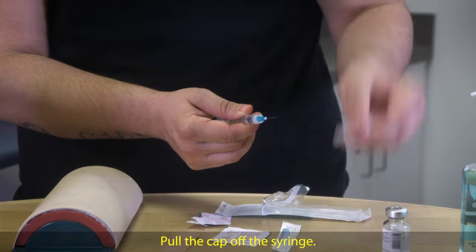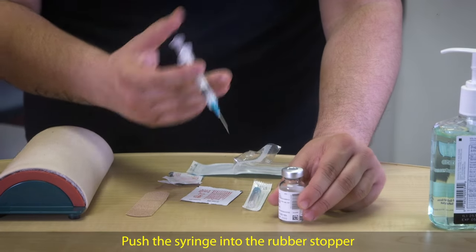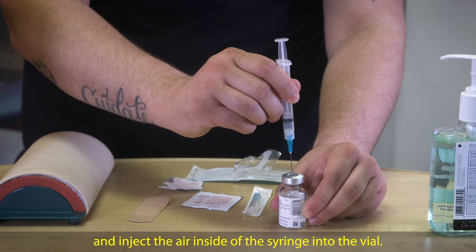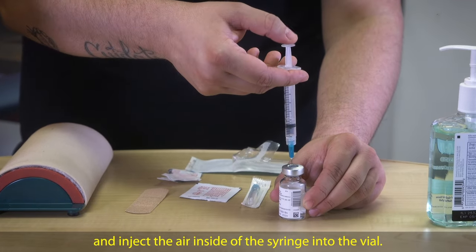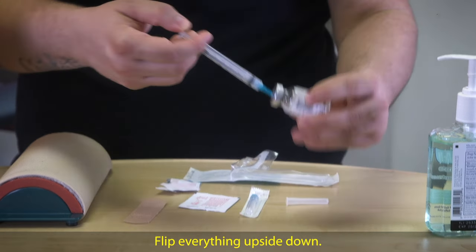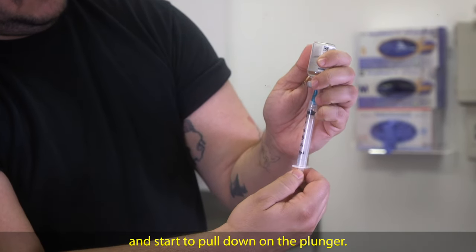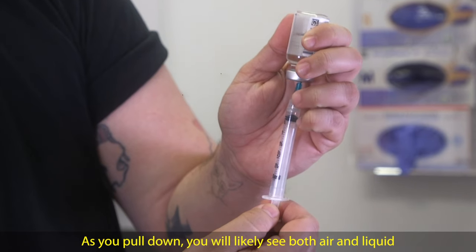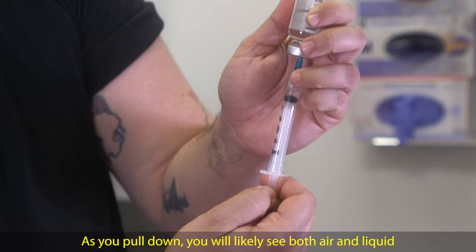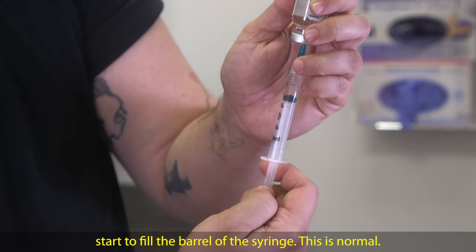Pull the cap off the syringe. Push the syringe into the rubber stopper and inject the air inside of the syringe into the vial. Flip everything upside down. Make sure the tip of the needle is in the liquid and start to pull down on the plunger. As you pull down, you will likely see both air and liquid start to fill the barrel of the syringe. This is normal.